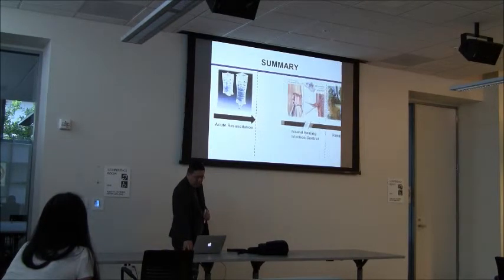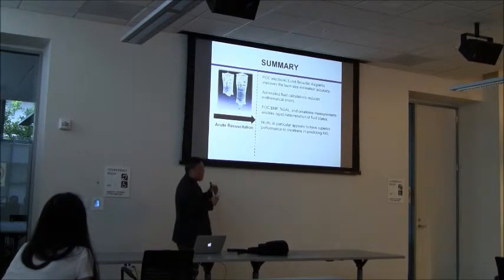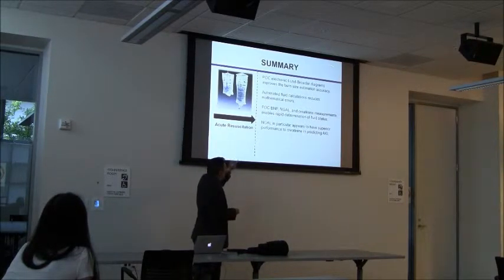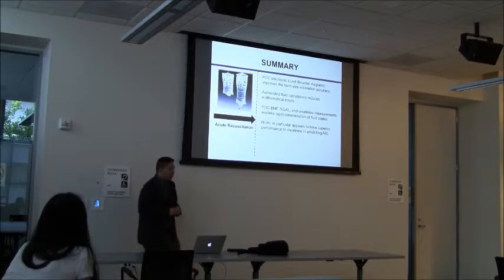All right, so in summary, point-of-care electronic burn diagrams, such as the Lund-Browder, can improve how we calculate and estimate burn sizes with accuracy. We can improve the automation of fluid calculations and reduce mathematical errors.